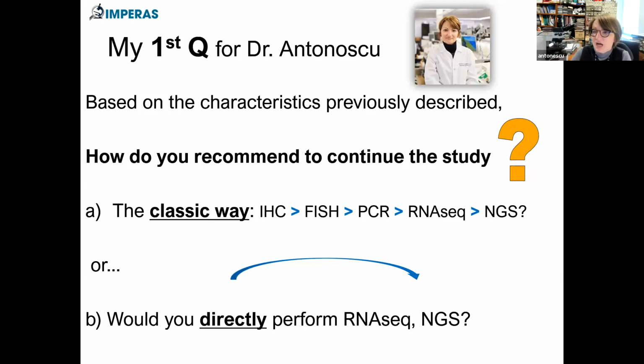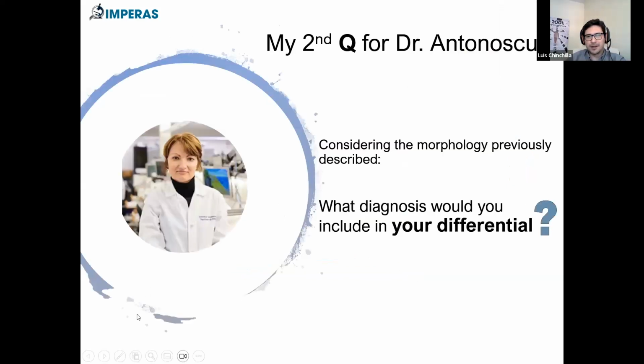Okay. So age-wise and the prior trauma, to me, it's more like a high-grade undifferentiated sarcoma type of entity, rather than a translocation-associated tumor. So first, of course, I will do IHC to make sure this is sarcoma versus carcinoma versus other things. Okay, thank you very much. You have answered my second question about the differential diagnosis.